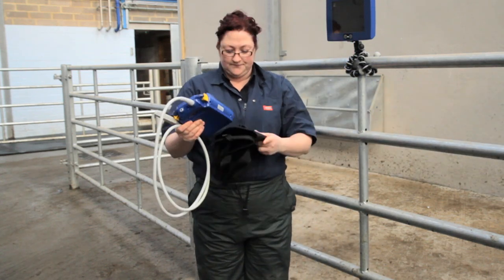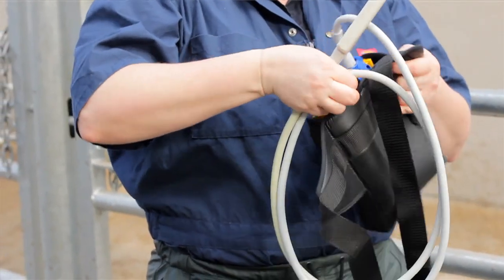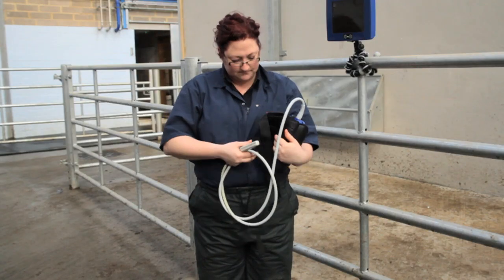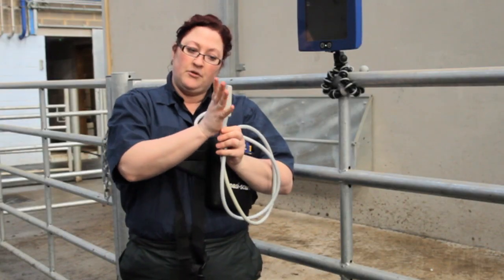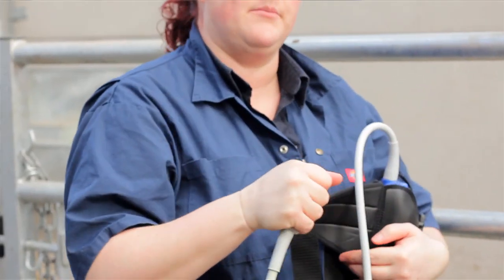We have a carry case — let me put that in. Next we'll go ahead and put the scanner on and then make some adjustments. Just as a note, remember to always hold the face of the probe in the palm of your hand so it doesn't knock against any gates and become damaged.